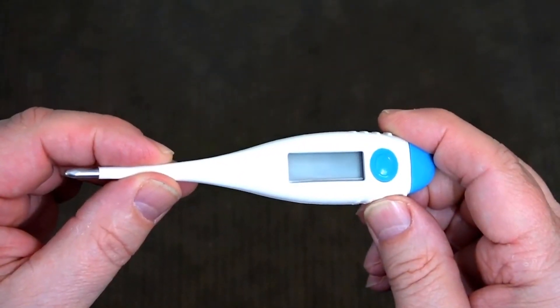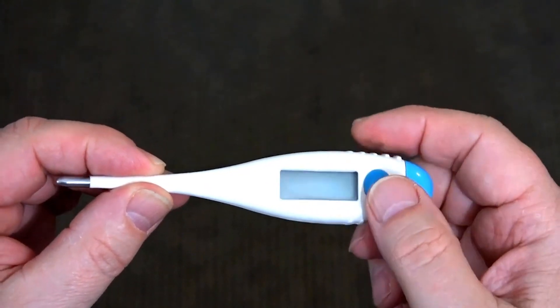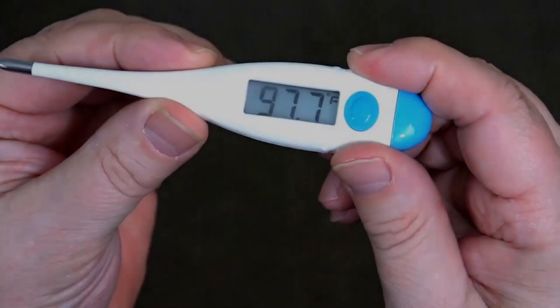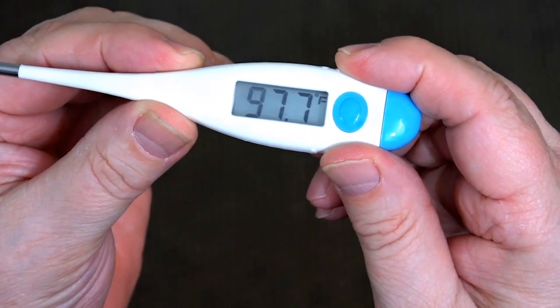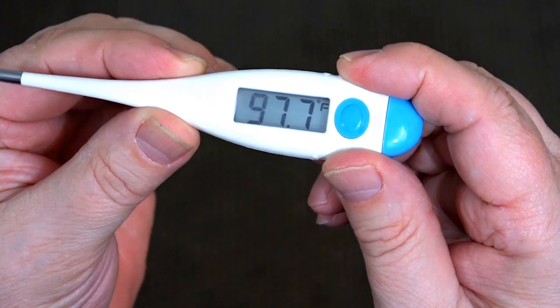Record the temperature of an FDA or CE approved clinical body thermometer. You will use this temperature as a reference for calibrating the non-contact forehead infrared thermometer.